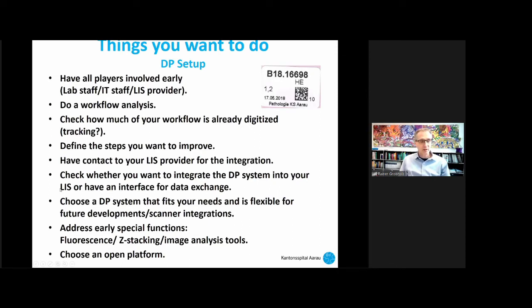That is a very important question, because it has an impact on your integration and on what kind of system you might want to choose. Choose a system that fits your needs and is flexible for future developments and scanner integrations, because most of the scanners have various file formats, and not all the DP systems support those.